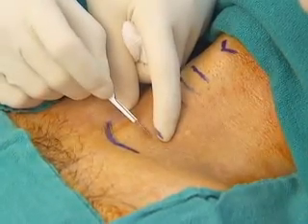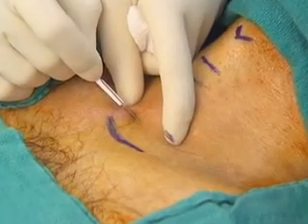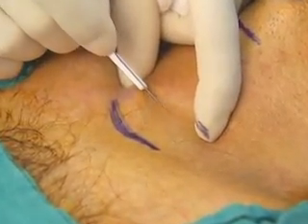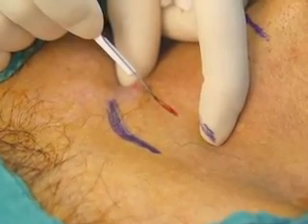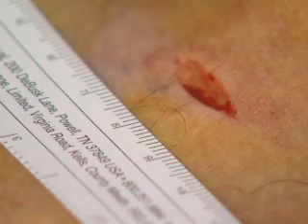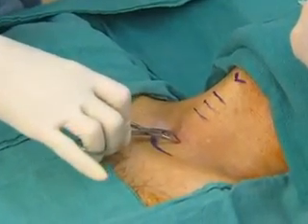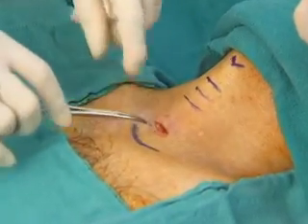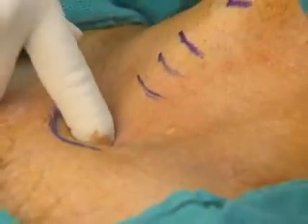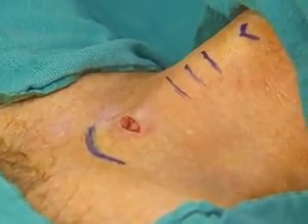A 1.5 to 2 centimeter transverse skin incision, just long enough to admit the tracheostomy tube, is made at the level of the first and second or second and third tracheal rings, approximately 1 finger breadth above the sternal notch. A curved mosquito or hemostat may then be used to gently separate the subcutaneous tissues vertically and transversely. Digital palpation is then used to free any tissue while identifying the cricoid cartilage and the tracheal rings through the incision.